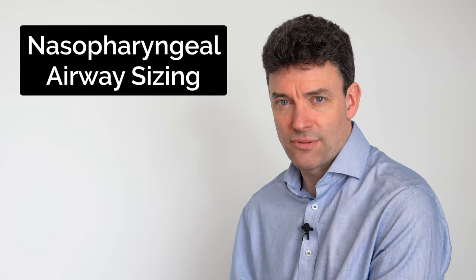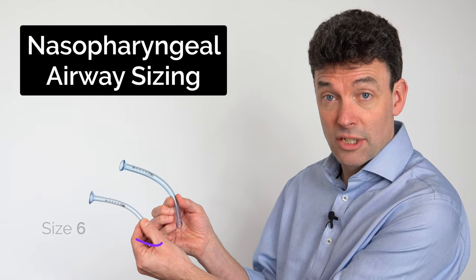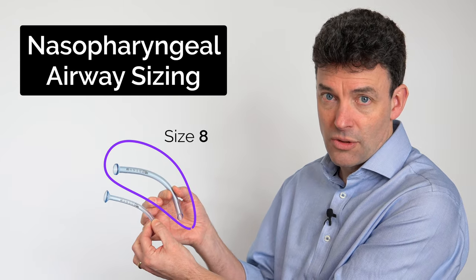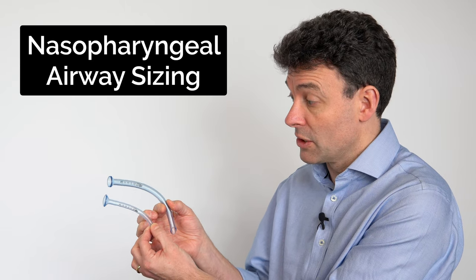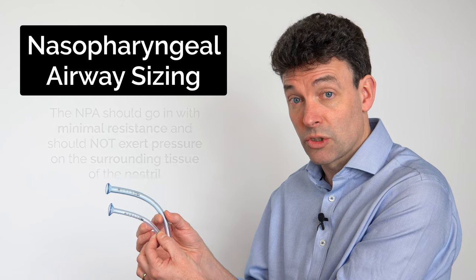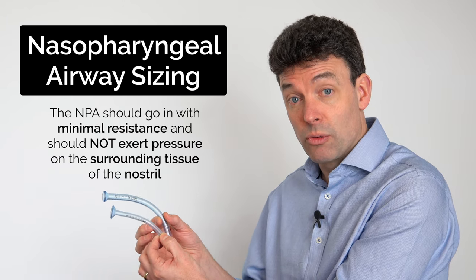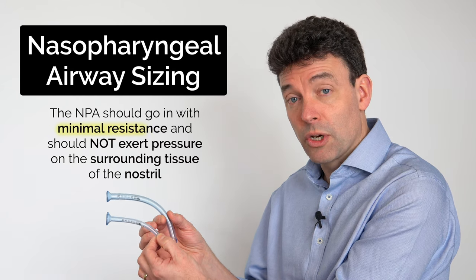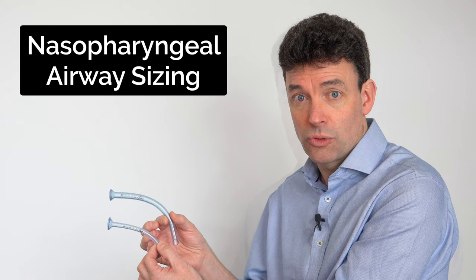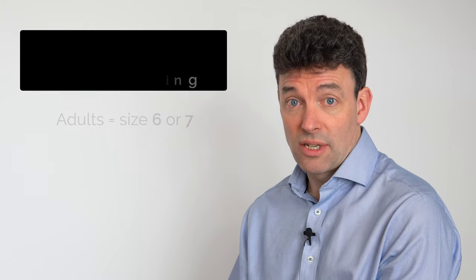There are several different sizes of nasopharyngeal tubes. For example, here are two — this slightly smaller one is a size 6 and this one is a size 8. There's no reliable way of sizing the right tube for the right patient; it's a matter of looking at the patient's nostril and seeing which size you're likely to get in. In general, you want to make sure the tube goes in easily without causing extra pressure around the skin of the nostril. Most adults will be fine with a size 6 or a size 7.